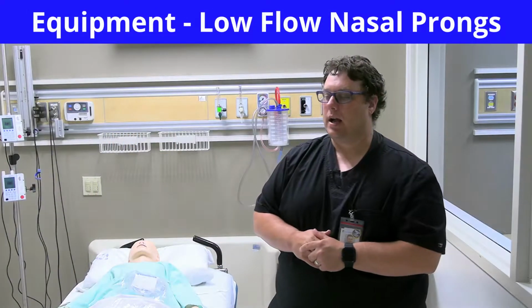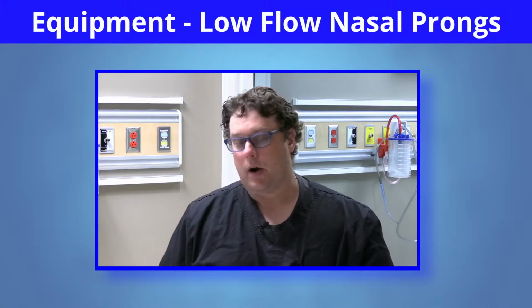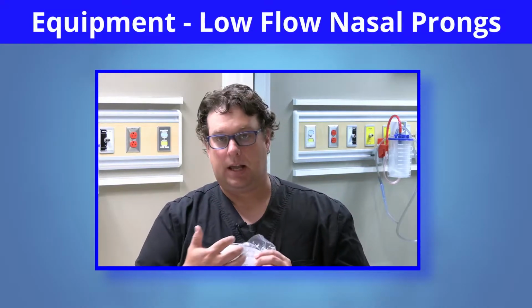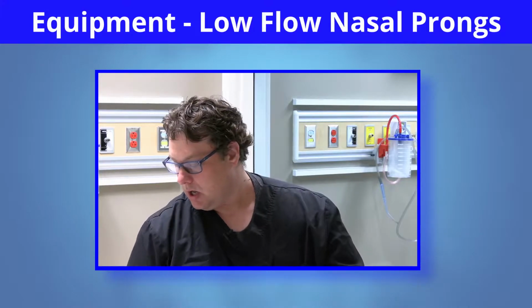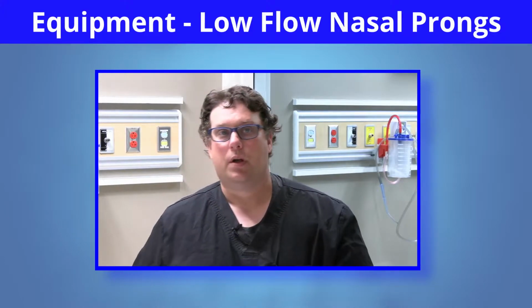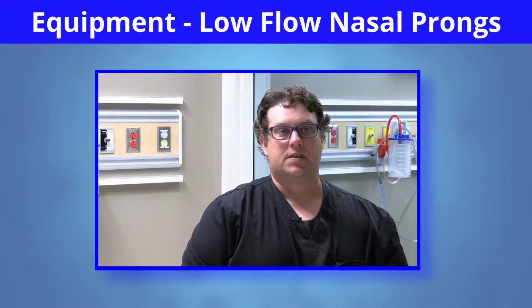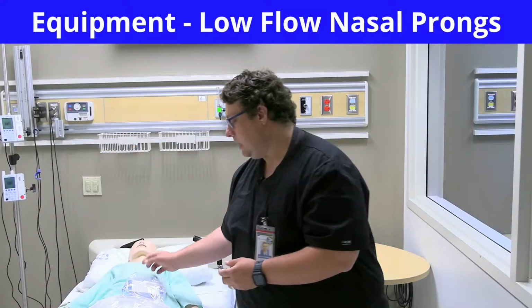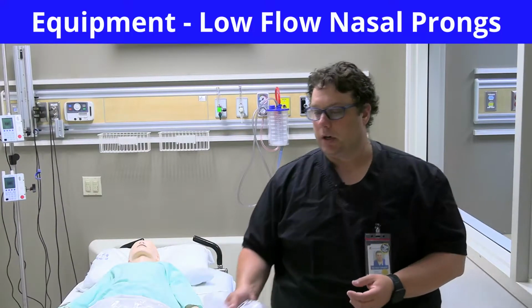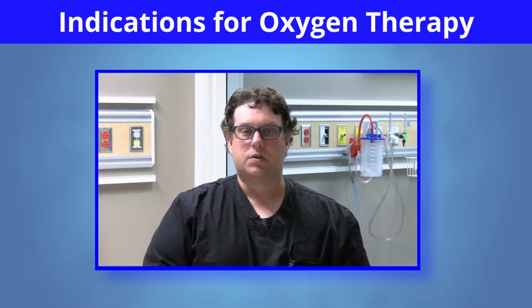So next we're going to talk about nasal prong oxygen therapy. And in front of me here right now I have 3 different sizes of nasal prongs. We have our infant, so again check your label for your sizing. We have a pediatric size nasal prong, and we also have adult. So again, you're going to select your size of nasal prongs based off the size of your patient. So currently here we have our pediatric patient lying in the bed here, which we're going to apply oxygen therapy to him. But before we do that, we want to talk about indications of use for oxygen.